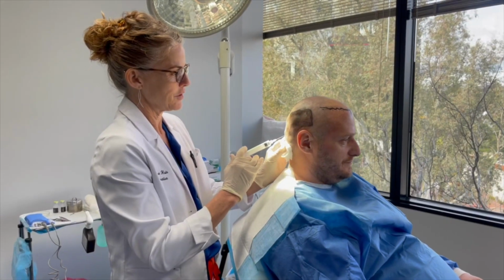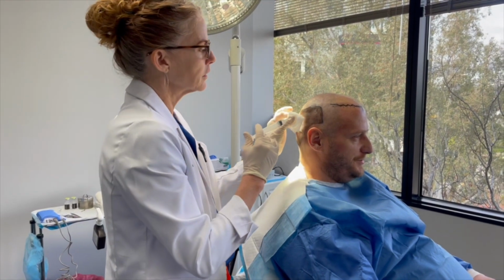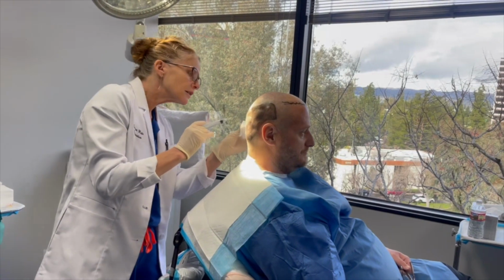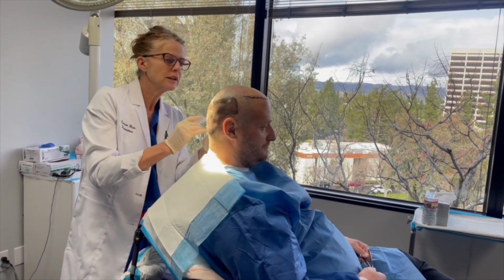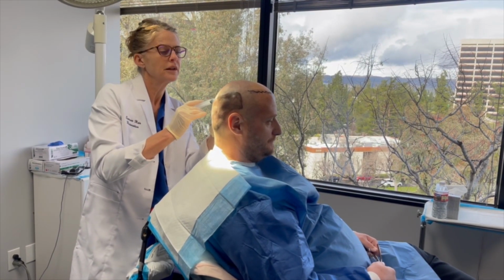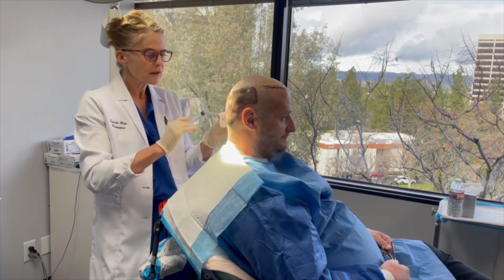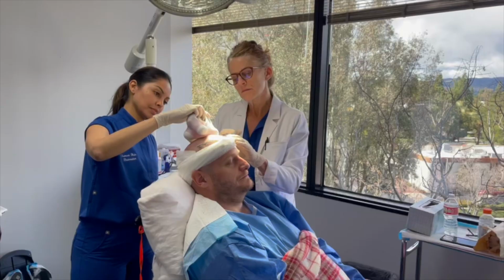Just to see if you're numb, just let me know if you feel this. Anything there? No? Little pinch. Okay, and how about up here in the corner? Anything there? Pressure. Good. Here. Just pressure. Good. You felt that one? Okay. Down here. Yep, really felt that one. All right, couple more down here. How about here in the corner? Nope. Good.